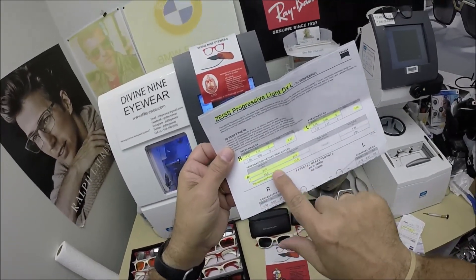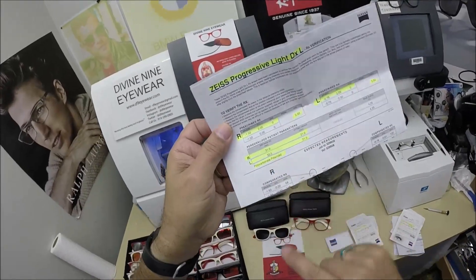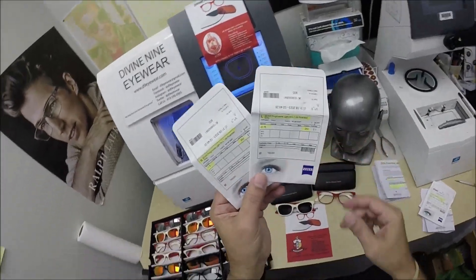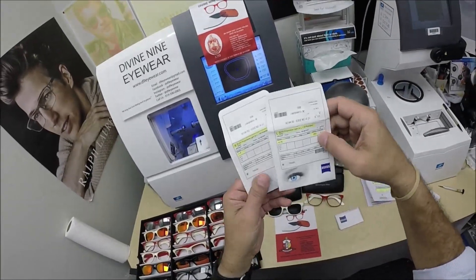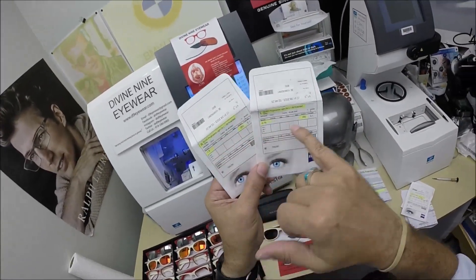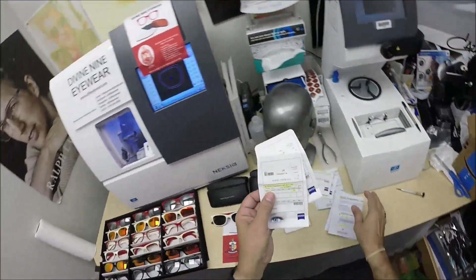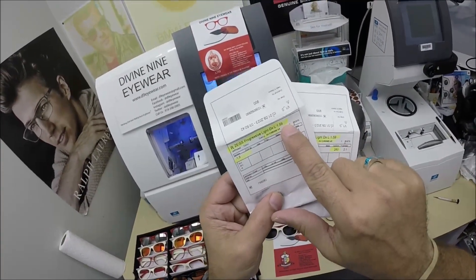I've documented the pupillary distance for the right and left eye, the optical center height, and polycarbonate polarized. Polycarbonate is 40% thinner and lighter than regular plastic, virtually unbreakable, with 100% UVA and UVB protection built in. These are the packets the circular lenses came in before I cut them to fit the frame. For the clear pair, it's the same: Zeiss Progressive Light D in 1.59, the refractive index of polycarbonate.